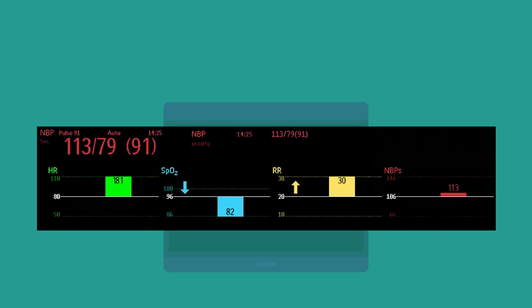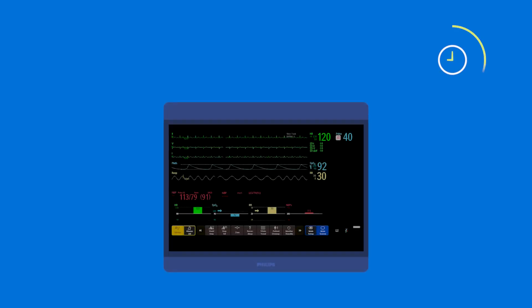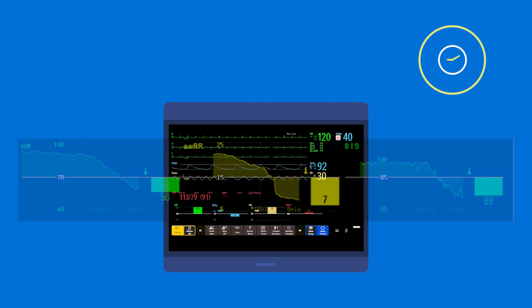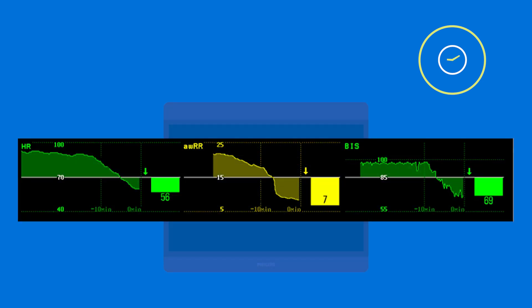A deviation bar shows your patient's current measurements in relation to a baseline you define. An arrow shows the general trend of your patient's condition over the past two, five, or ten minutes.